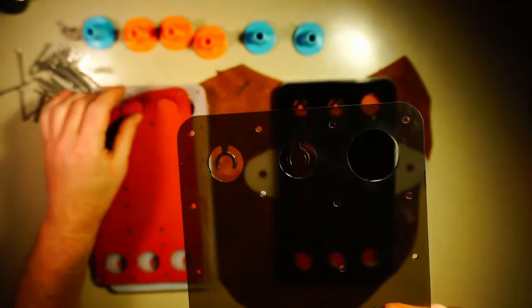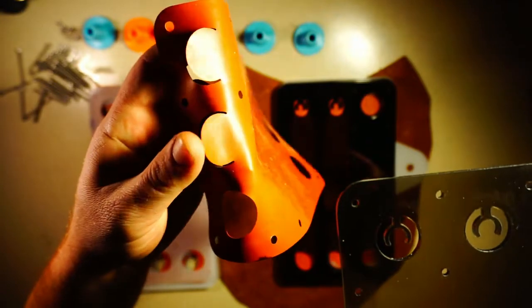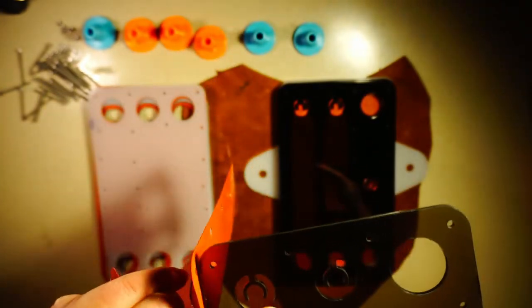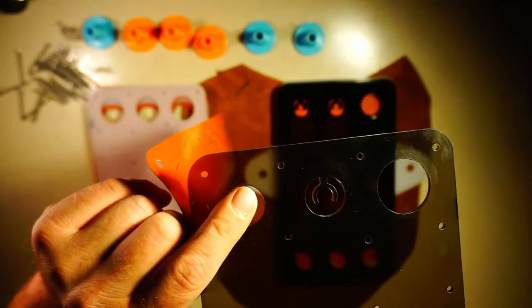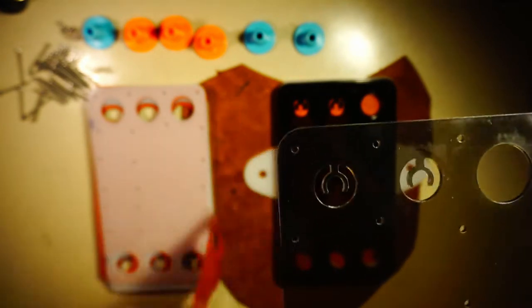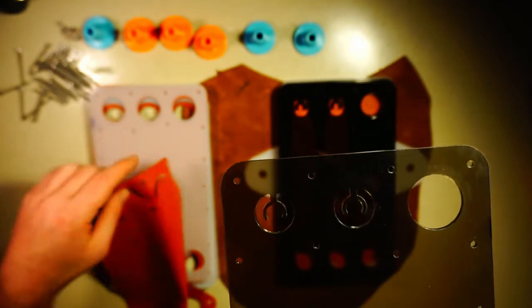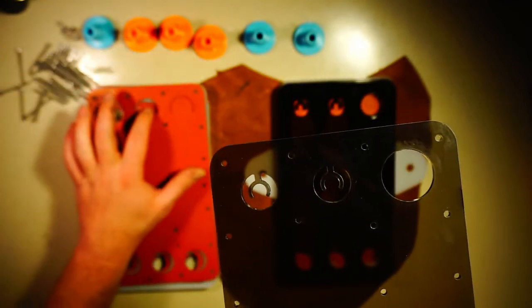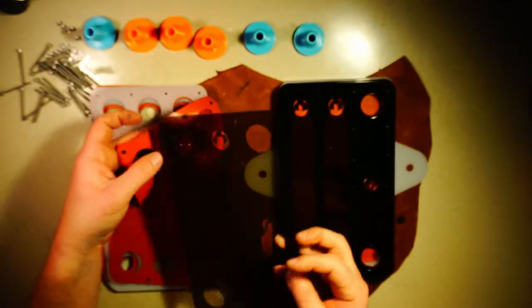As well, the diameter of these holes, or these valve flaps, is larger than this diameter in the back of the check valve port, and smaller than this diameter here in the front of the check valve port. So these valve pieces can move in this direction, but they cannot move in this direction.